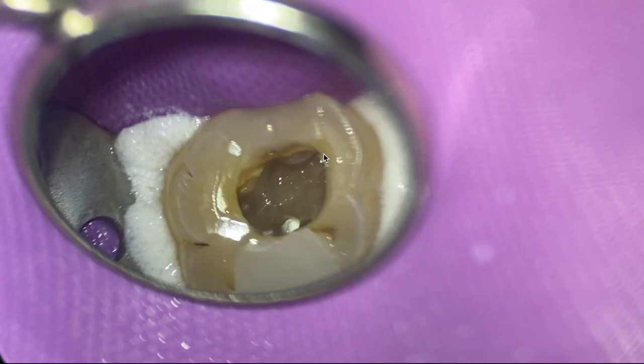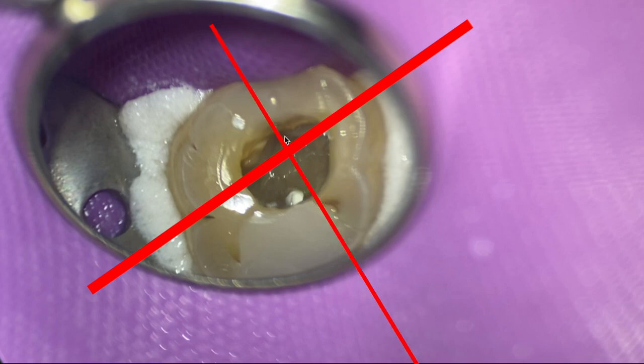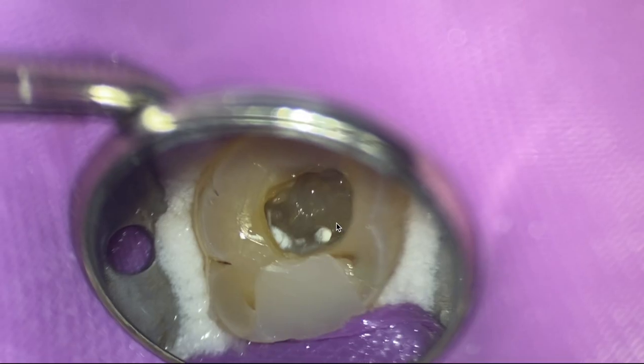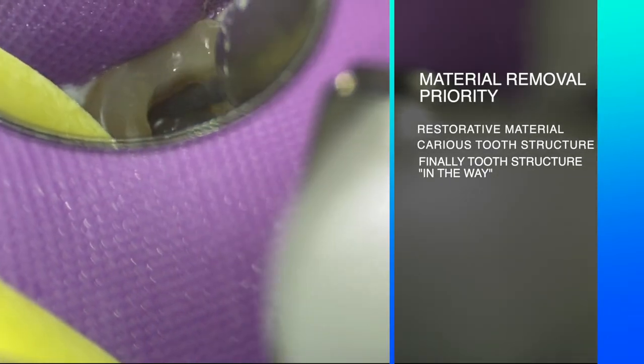So let's just give you some coordinates here. This is the buccle cusps, palatal cusp, mesial marginal ridge, distal marginal ridge. You can see there's a composite. This is the entrance into where MB2 was initially, and it's pretty much in line with one of the tricks I learned in residency. If you draw a line from your mesial buccal one orifice to the palatal orifice, and then a line bisecting that from your distal buccal somewhere around here, you typically aim around here.